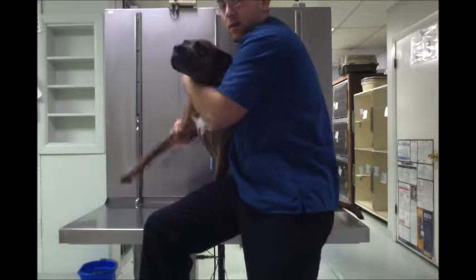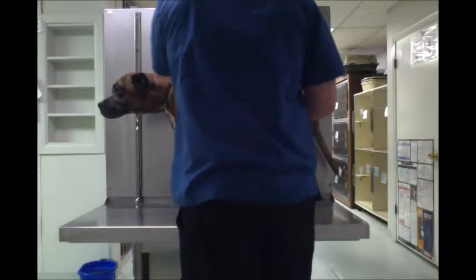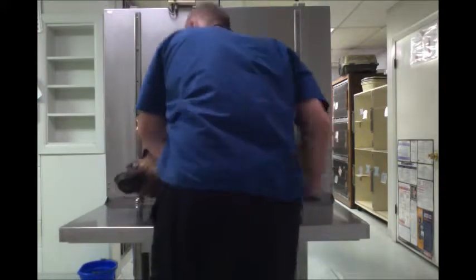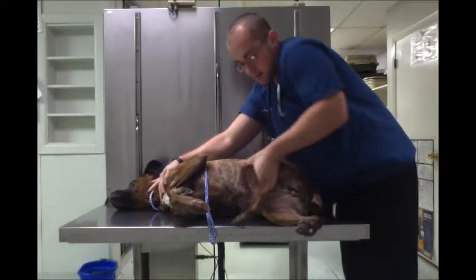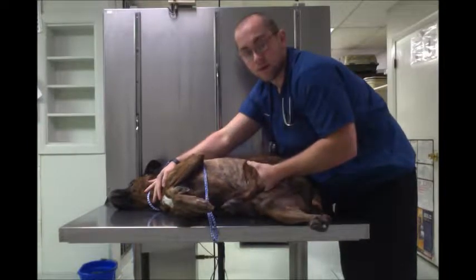And then saphenous, we'd want them on their side. We would want to grab that hind leg just like this so you can roll that vein, and it'll pop out for your drawer like that.